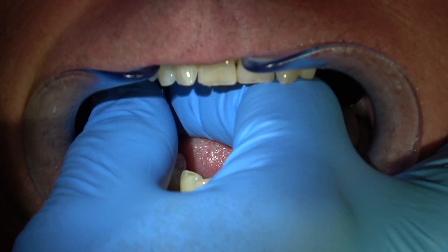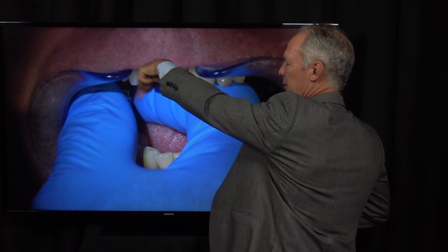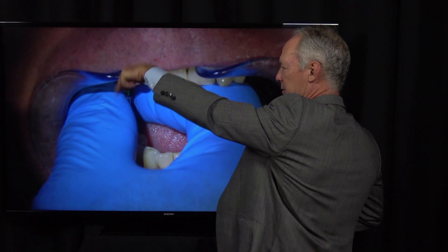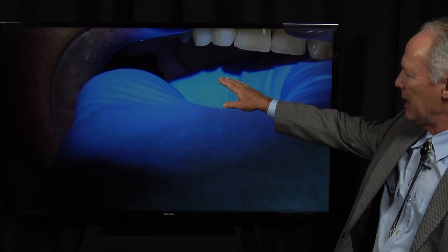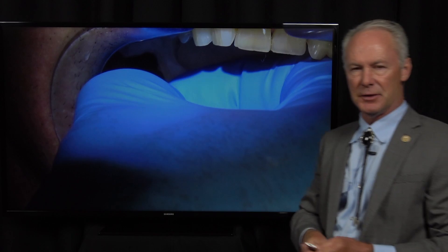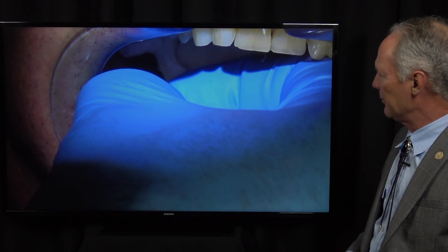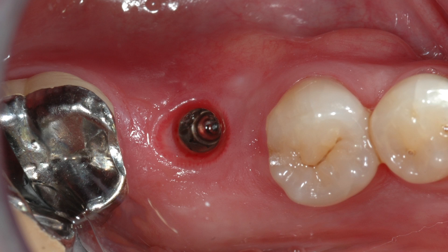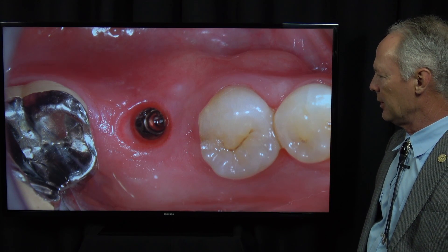Now I'm going to unscrew the healing cap. Which way are we going to turn this? Lefty, loosey — counterclockwise to loosen. I've got a two-by-two in the back of his mouth because you don't want to take any chances on dropping the screwdriver. See how beautiful that emergence profile is around the implant — and that's after about three weeks of healing.